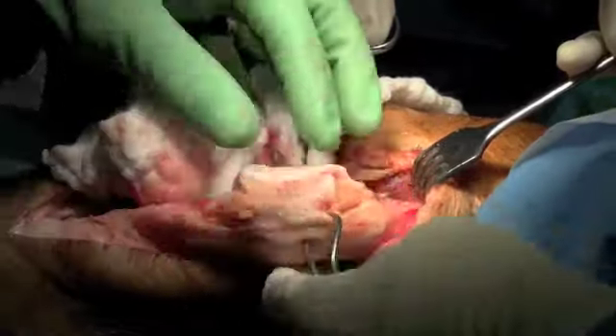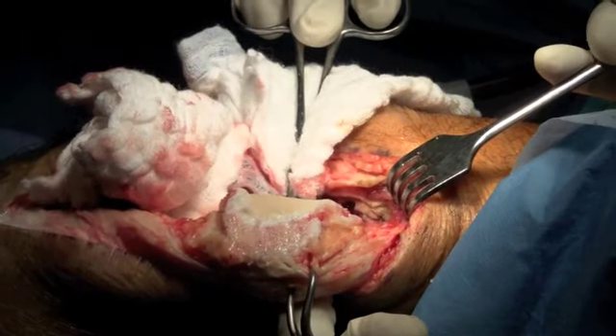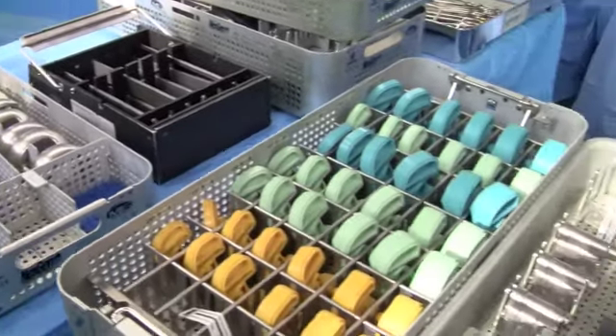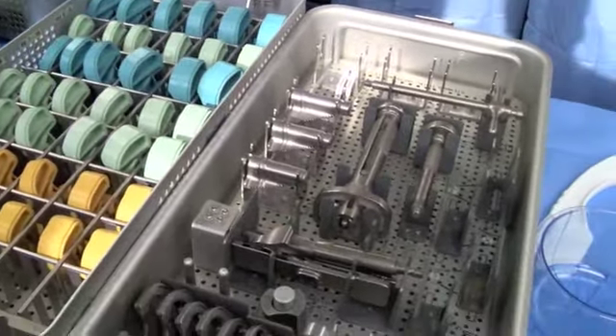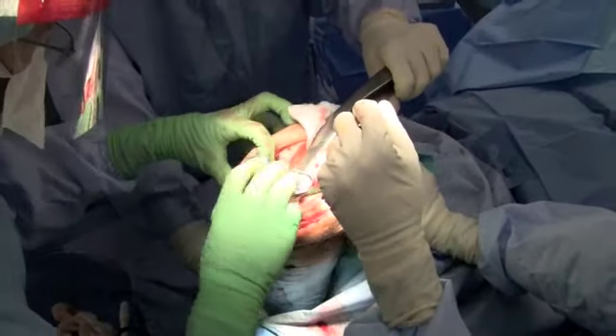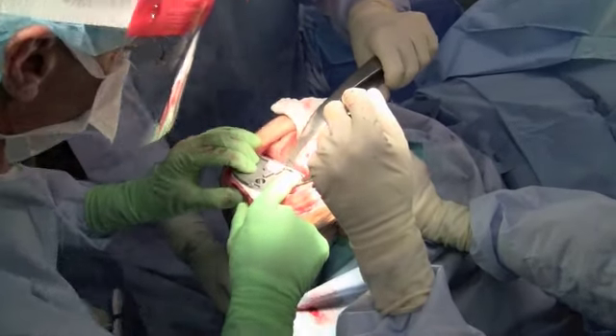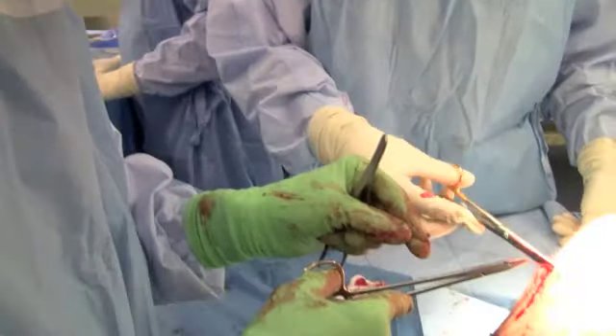The basic procedure involves moving the kneecap off to the side, reshaping the ends of the two bones, choosing the appropriate size of components, and attaching those components to the bone. This is generally done with a cement that fits between the metal and the bone — much like a grouting to fill in the gaps — and then sewing up the knee.